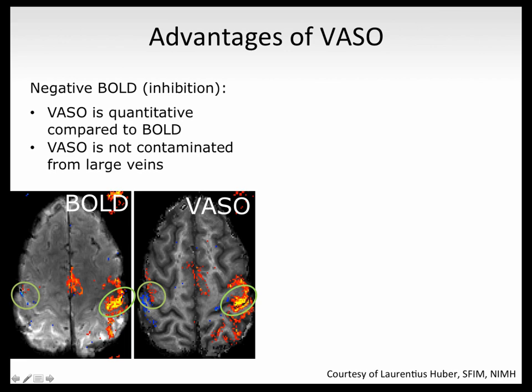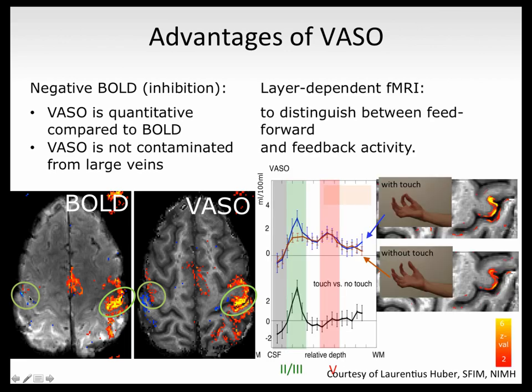Same thing on the other side, where instead of a positive influence, you've got a negative cancellation. This is sort of useful if you're interested in doing layer-dependent fMRI. You can actually distinguish between the two sides of the sulcus, and you get really nice resolution that way.